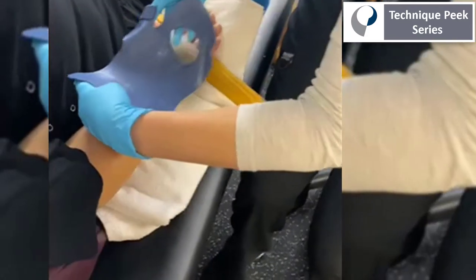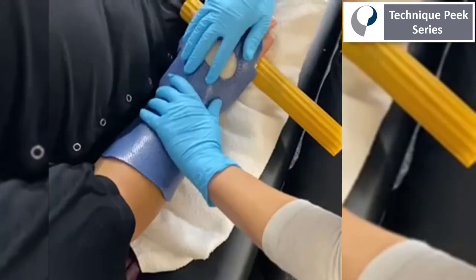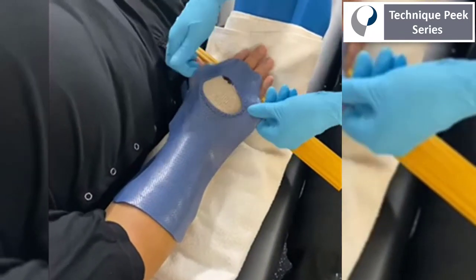We're going to position the patient supported in slight wrist extension. Due to the fact that they have no active wrist extension, it's important that we use something like a flex bar or a pillow to put them in the right position as we mold the dorsal splint.